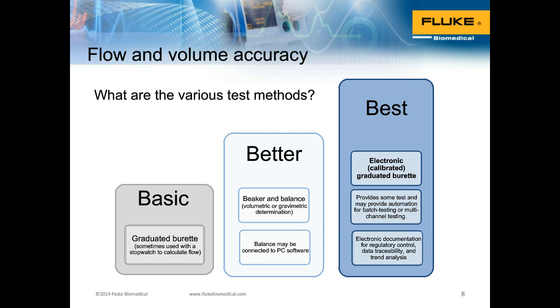But that doesn't mean that you have to use that method. It's not a requirement. It's a recommendation based on how they test. But many biomeds use the basic method, which is the graduated burette, or the next one that I'm going to talk about, which is an electronic device. What an electronic device does is, based on different types of technology, calculate the flow measurement for you.